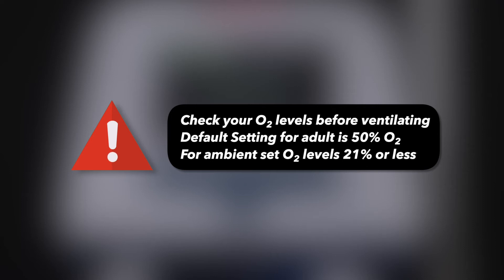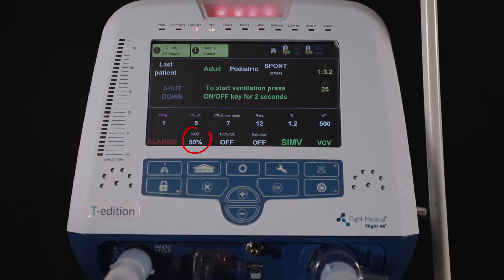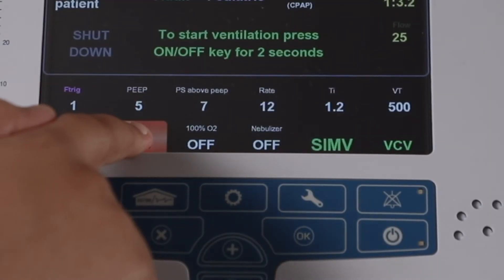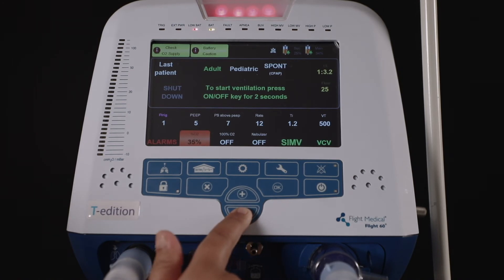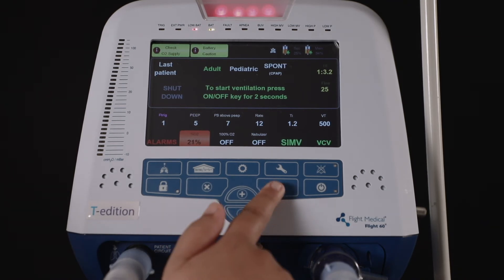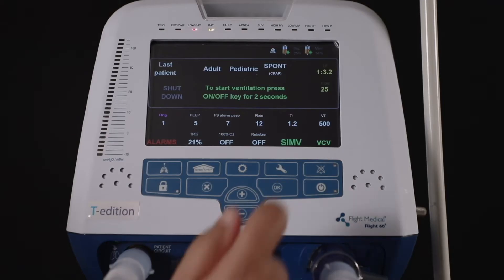For demo purposes, the oxygen percentage is set at 21%, as the demonstration is being done with ambient air. To change the oxygen percentage, select O2, then press the plus or minus button according to your requirements. Bring it down to 21% and press OK. Then press the alarm button to switch off the alarm.